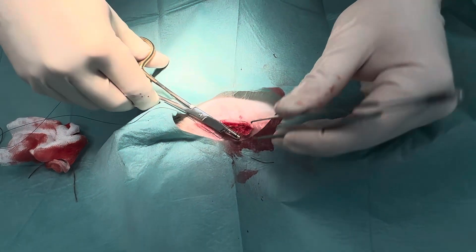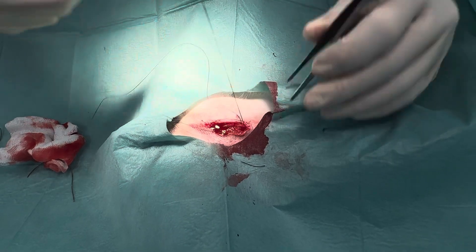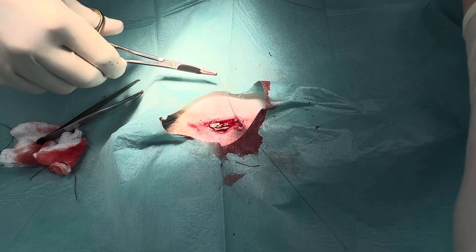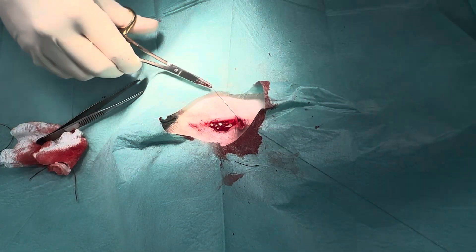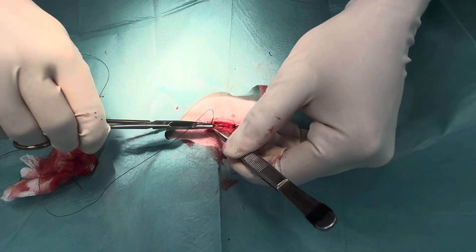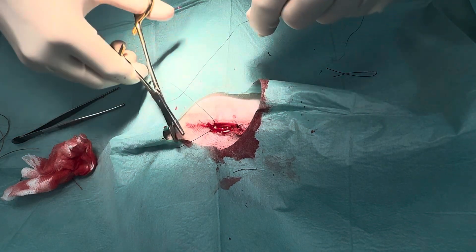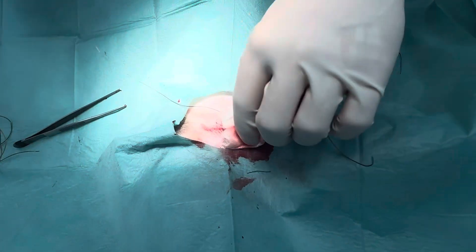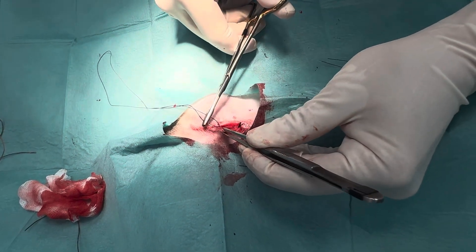I tend to find holding with rat-tooth forceps is much easier. So this is the end of this layer here. I'm going to finish with an Aberdeen knot. Now we're going to do our intradermal sutures, which I find work really well in these small surgeries.